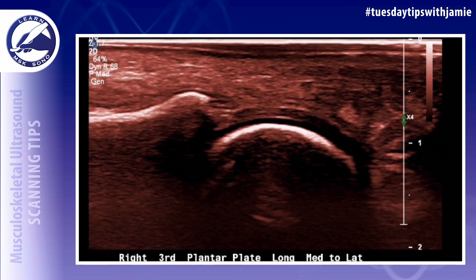First, use a lot of gel and a high frequency transducer. A linear transducer or a hockey stick may be used.